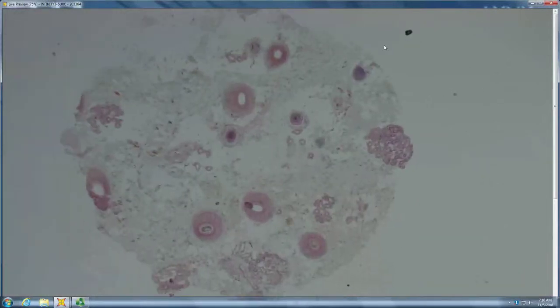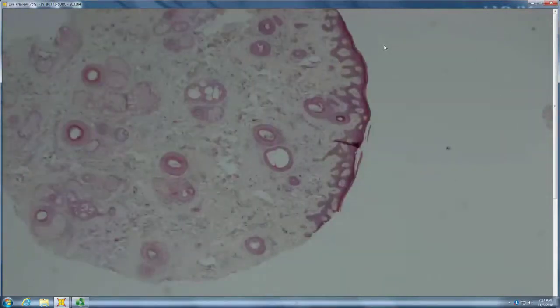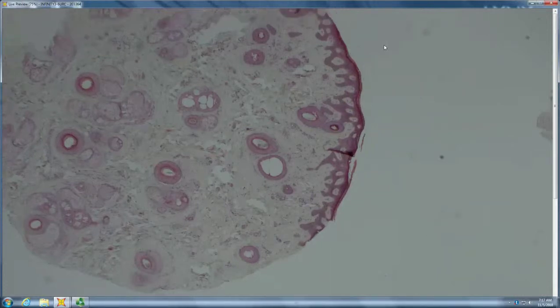Lisa, you wanna start us off? Sure. So, it looks like we have varying diameters of hair follicles. If you were looking at a blood smear, you would say anisocytosis, right? So this is anisotrichosis, big circles, little circles. Give me two things that give you varying hair shaft diameters or hair follicle diameters. Pattern, and I think alopecia areata. Yeah, so pattern and alopecia areata are the two.